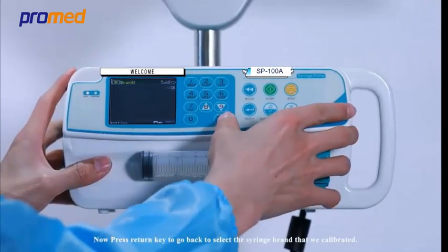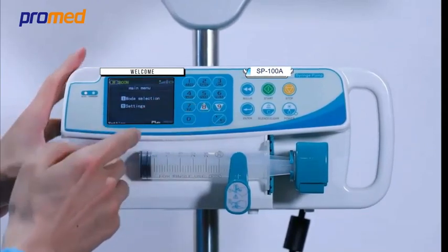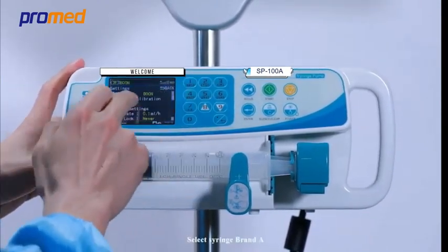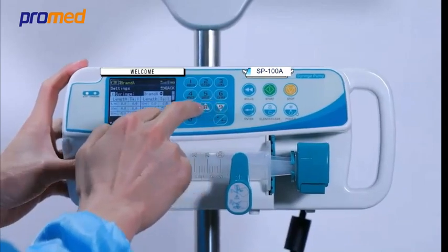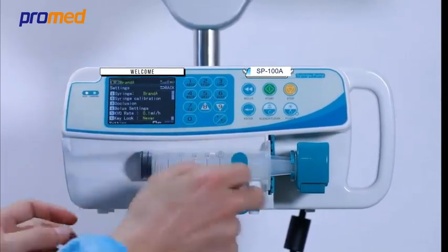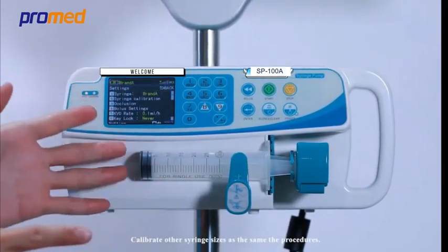Now press the return key to go back and select the syringe brand that we calibrated. Select syringe brand A and press enter. Calibration is now finished. Calibrate other syringe sizes using the same procedures.